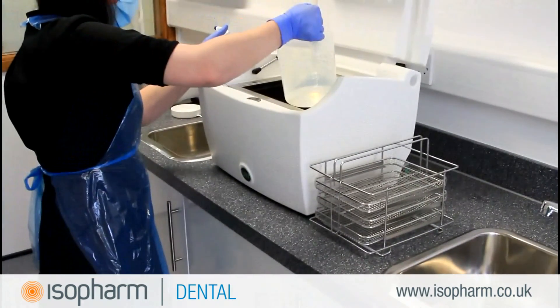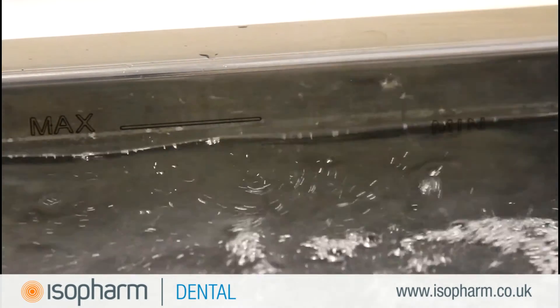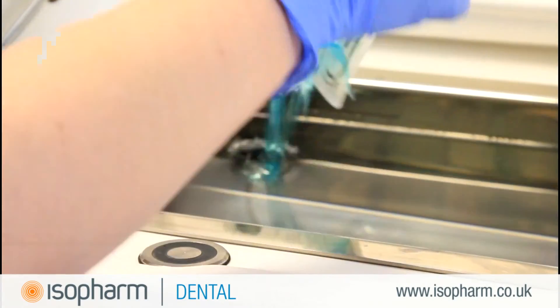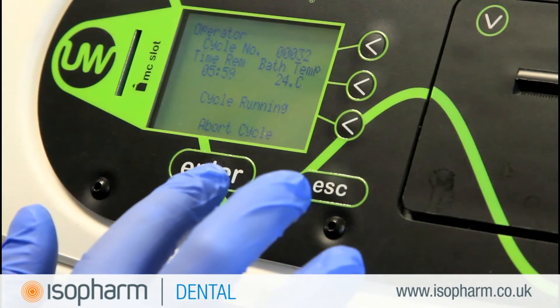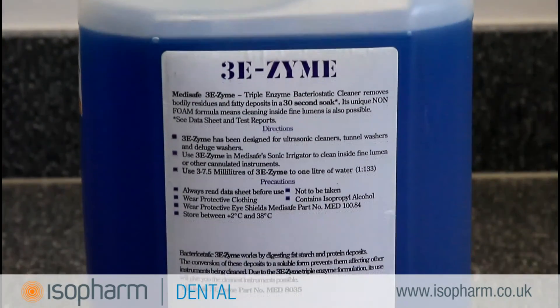Instruments that are failing the visual inspection after processing through an automated cycle such as an ultrasonic cleaner or washer disinfector can be a result of the wrong detergent being used. The type of detergent is usually recommended by the manufacturer, so check your machine manual. Whatever detergent you use, make sure it is used in accordance with the chemical manufacturer's instructions.